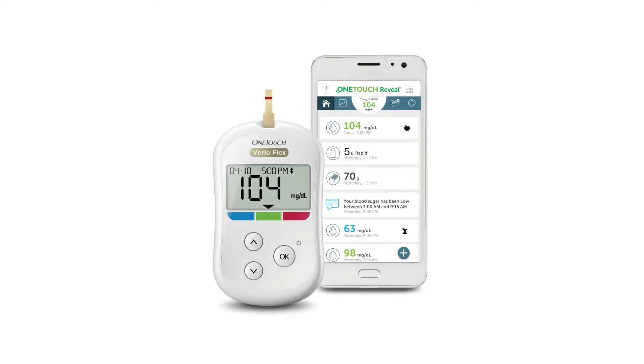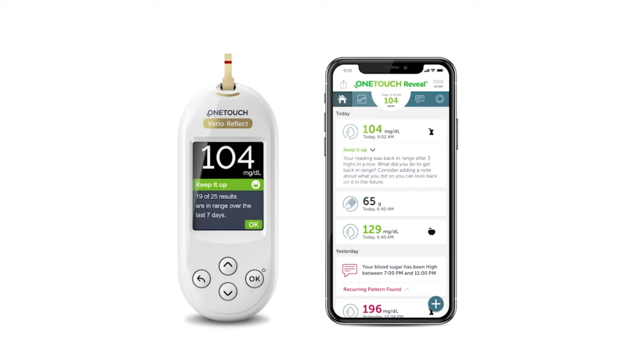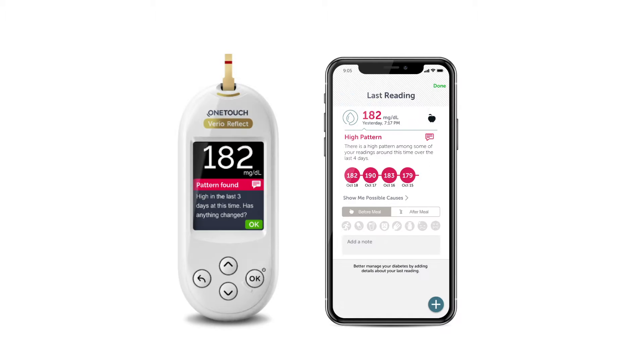The OneTouch VarioReflect meter provides you a number and helps you to understand what that number means. The OneTouch Reveal mobile app allows you to see patterns and set reminders to help you manage your diabetes. With the OneTouch VarioReflect meter, you will get personalized guidance, insights, and encouragement. When paired with the OneTouch Reveal mobile app, it gives you more insight and helps you see patterns.